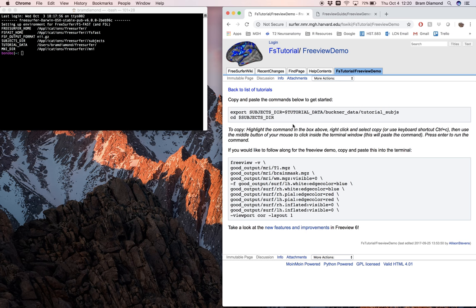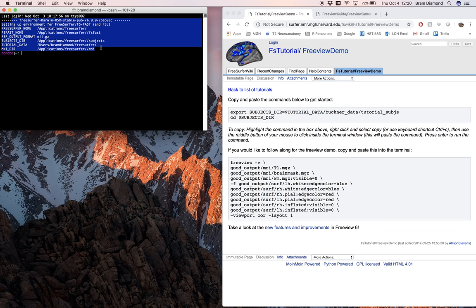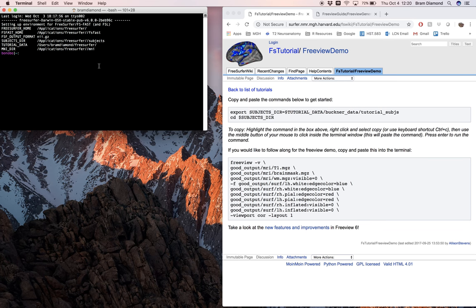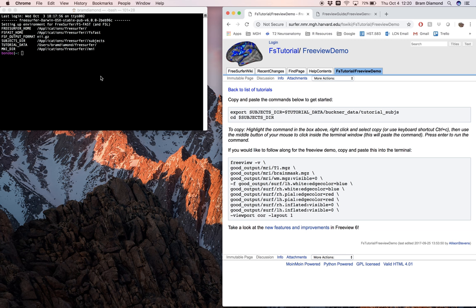Before I continue, I just want to remind you to always call FreeView from the command line. It's good practice since you're calling it from the FreeSurfer sourced environment, and you have all the appropriate variables set. Clicking the dock application can cause some problems, so make sure to always use the terminal when opening FreeView.